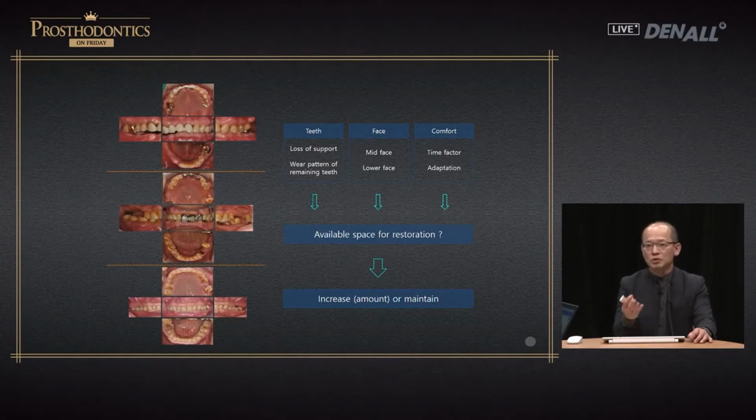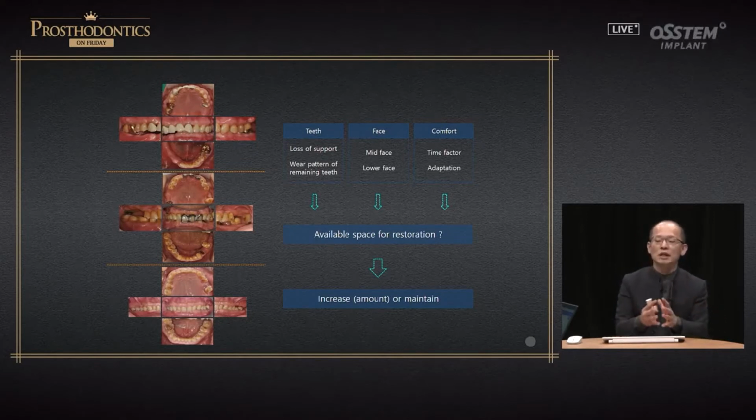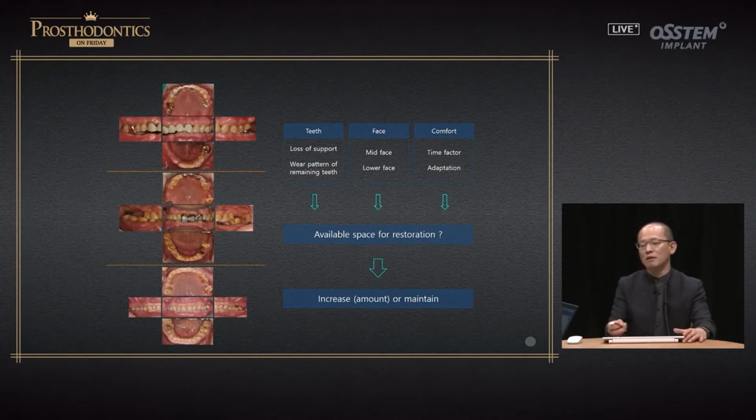That would make things a lot easier. In terms of rehabilitation, a sufficient full restoration is key. As I said before, aesthetic consideration needs to be made, and whether it has comfort for the patient is also key. Clinically, securing VD and setting the occlusal plane is important.